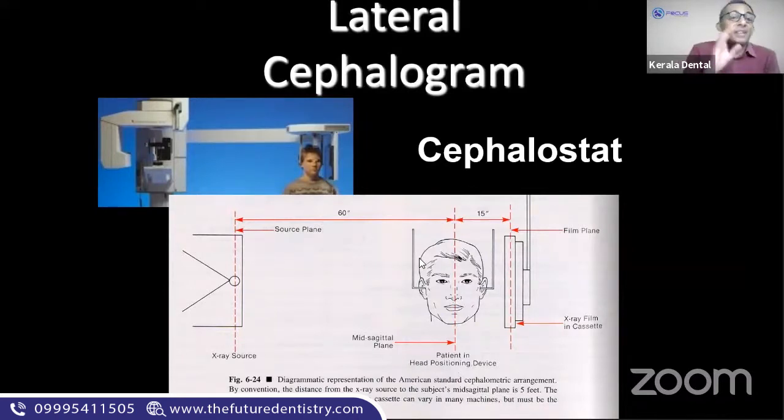I've even seen questions being asked on how much is the focal length of this X-ray source. How much is that? 60 inch, 5 feet. I've seen questions on that also on national boards and even NEET. Last year NEET, I think this came, 60 inch. But the point I'm trying to cover here is all over the world, you take your kid for a lateral cephalogram X-ray.